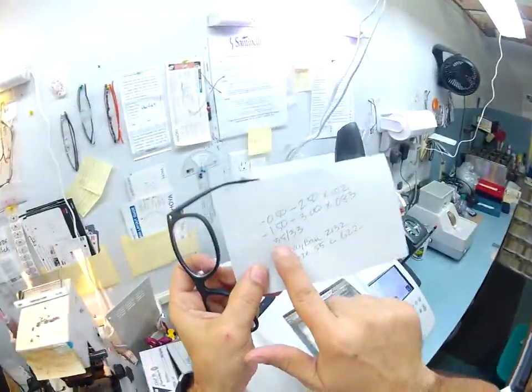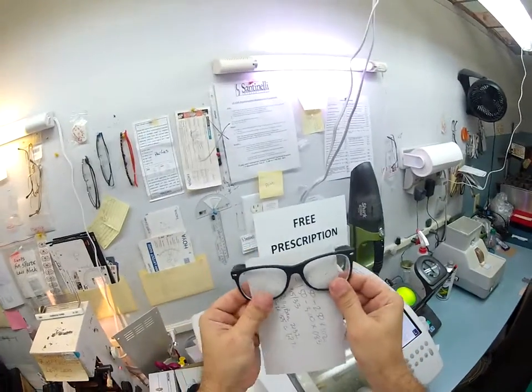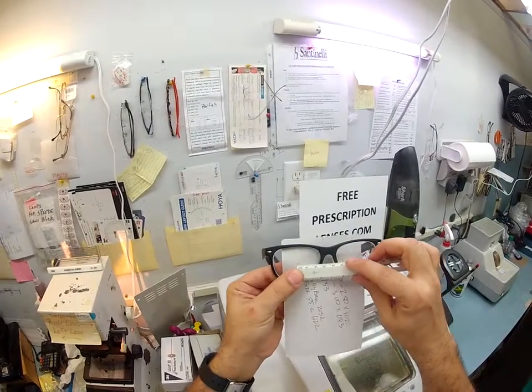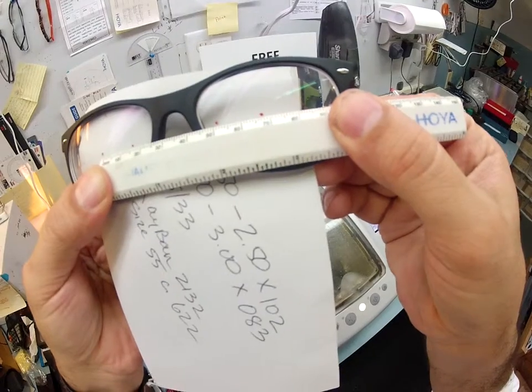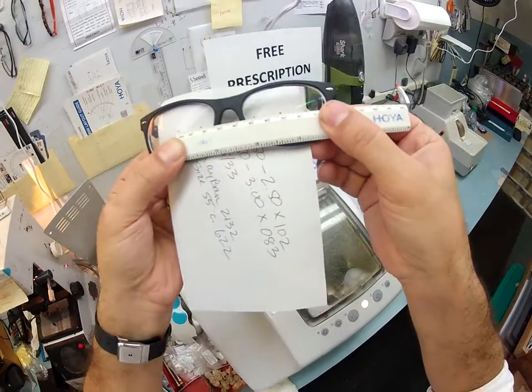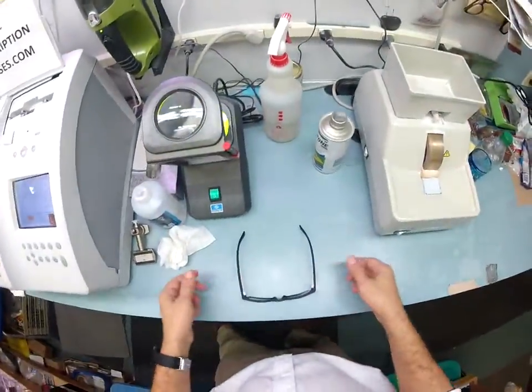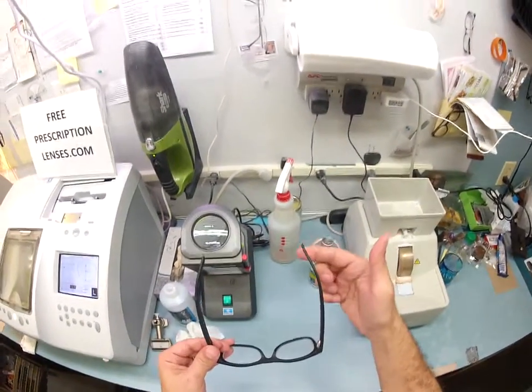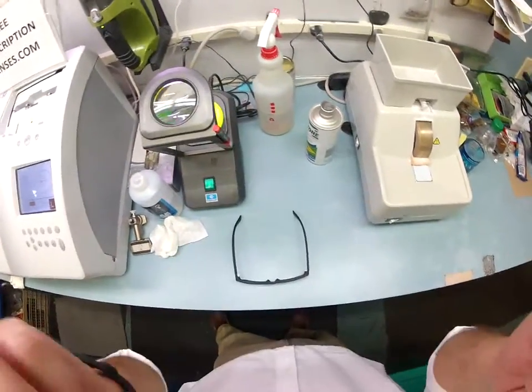Those two red dots — your pupillary distance is 35 for your right eye and 33 for your left, for a combined PD of 68. When I hold my pupillary stick up with the zero on your right lens, we are getting 68 millimeters over the left lens. That is dead on perfect. The last thing I want to do is make sure your frame is in standard alignment, meaning that when I put it on the counter it's in a three-point stance — one, two, and the bottom of the frame being three. When I put them down, there is no wobble.